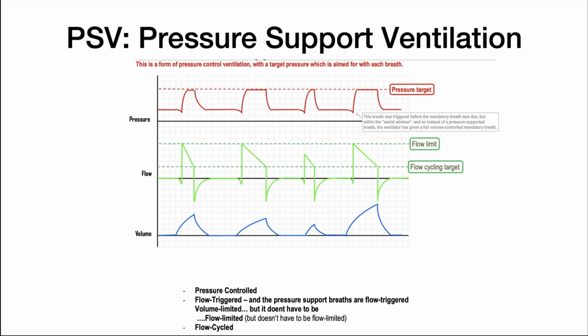A certain level of pressure support is needed to overcome the resistance of the ventilator circuit and endotracheal tube. This is typically less than 10 centimeters of water, although it can be higher with narrow tubes. Pressure support above that needed to overcome the artificial airway resistance supplements the achieved tidal volumes. Typical pressure support settings are 5 to 25 centimeters of water. When full ventilatory support is needed for a patient, PSV may not be the ideal mode because it requires a higher work of breathing and minute ventilation is not guaranteed.